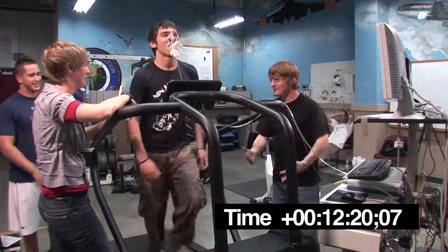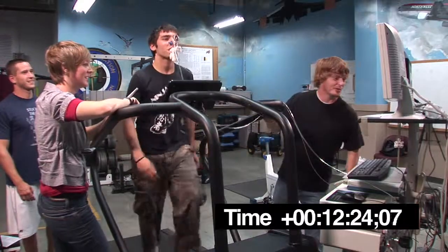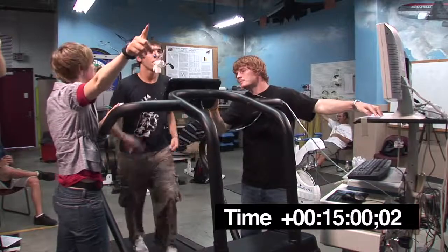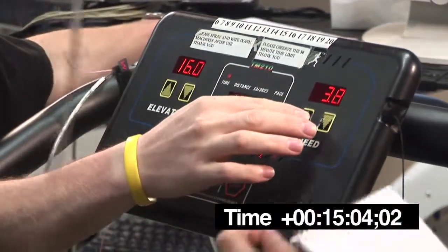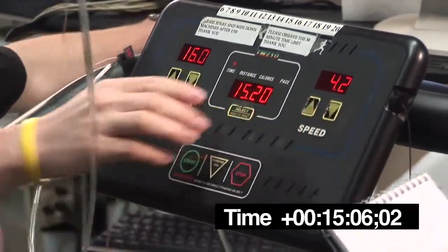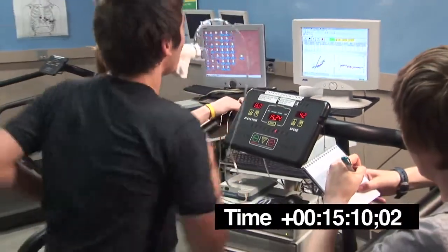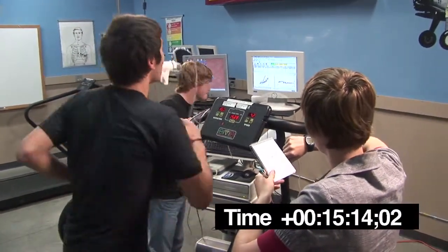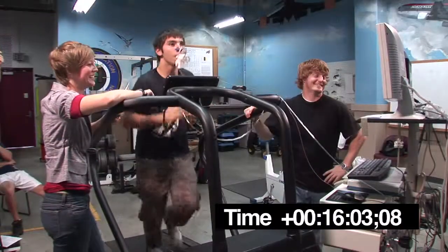This sucks, doesn't it? You can't jog, but this is gone. The next one won't be as bad — you'll be able to jog in the next one.